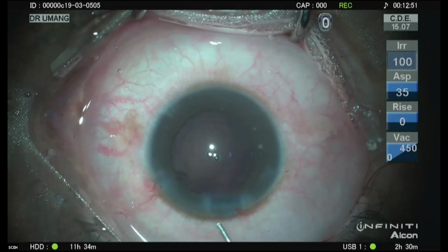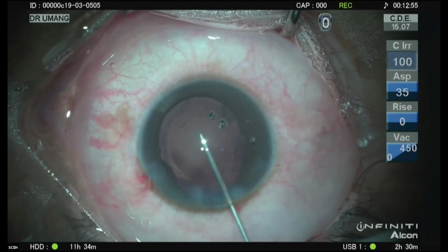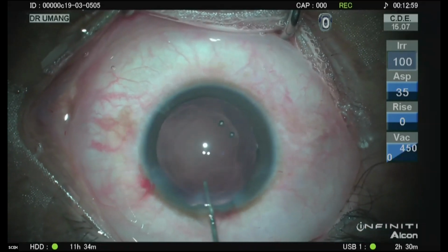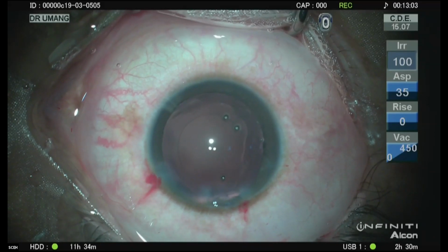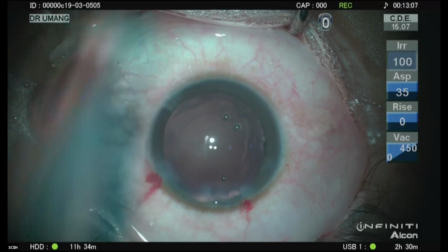Lens, please. So that's the duo visc, which will make a Visco, please.